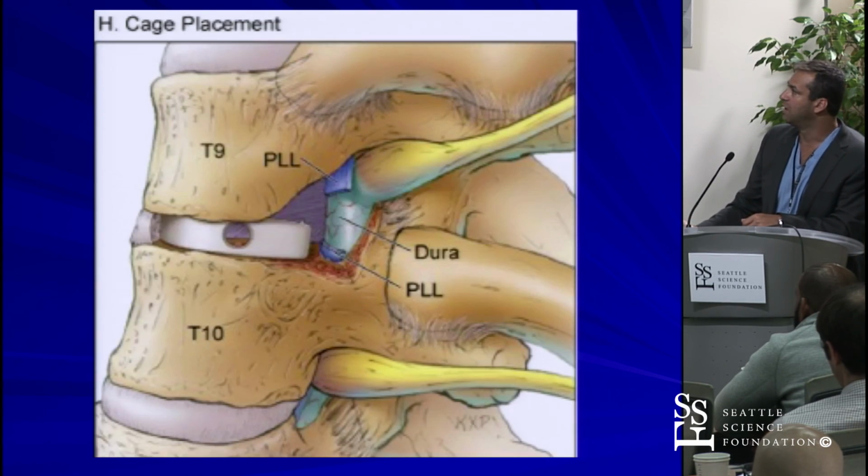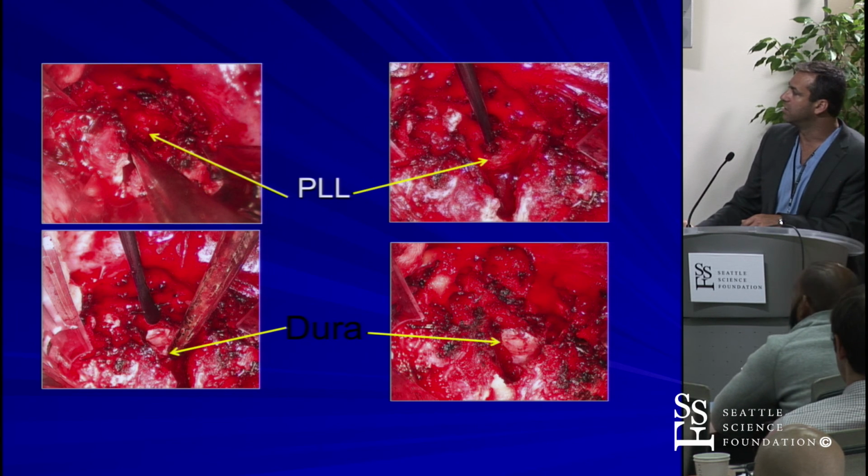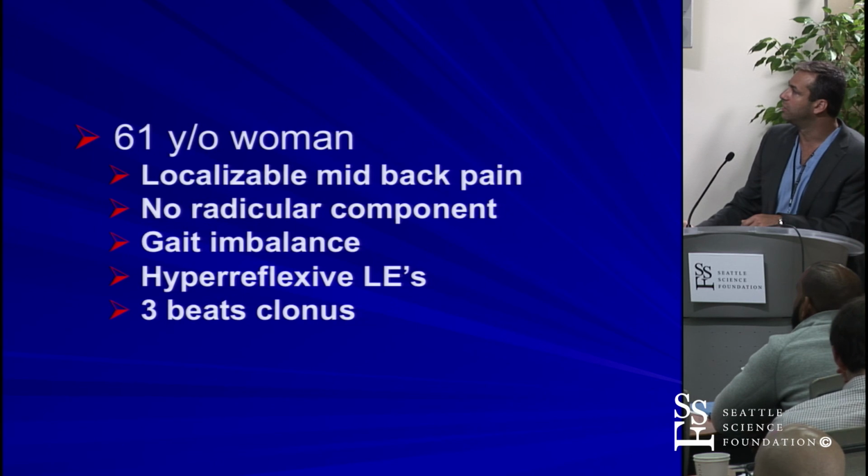PLL as you're performing this maneuver, and there's the cage placement postoperatively, and very similarly, again, showing the beginning and then each step, and finally the dura nice and freely decompressed with the pathology removed.